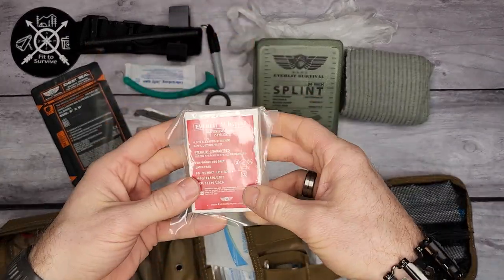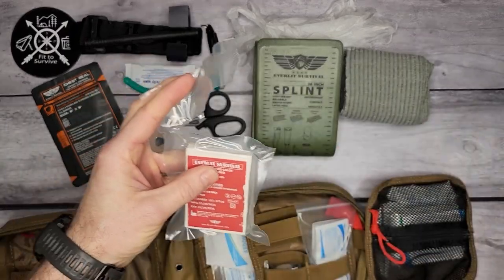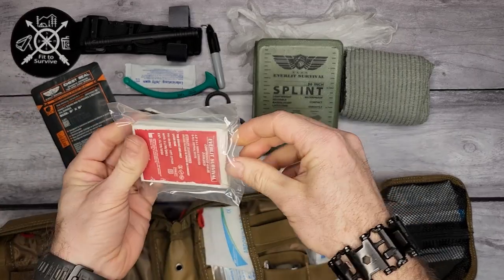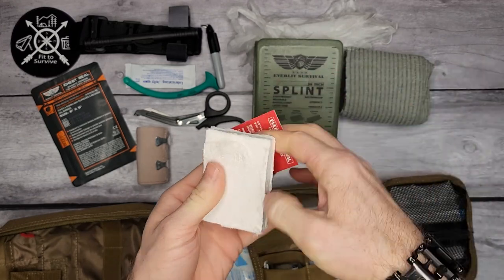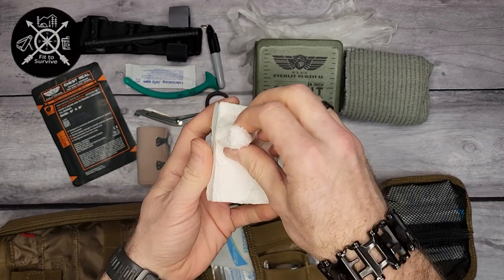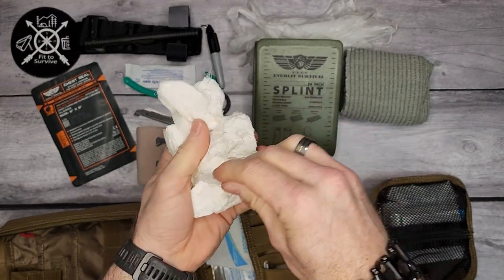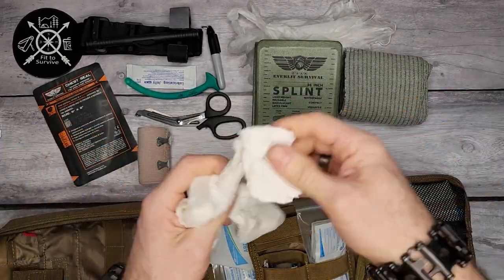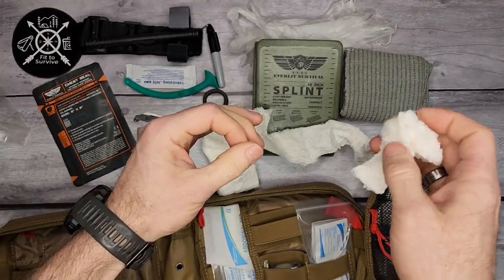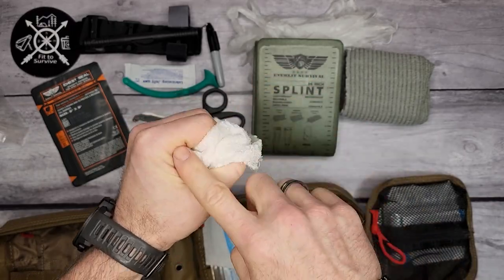Next in here is their compressed gauze — it is Z-folded. The Z-fold is usually used for packing a wound. If you have a serious cut that you need to pack, you pull this out and shove it into the wound to stop a serious bleed.